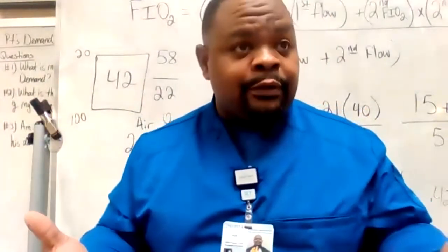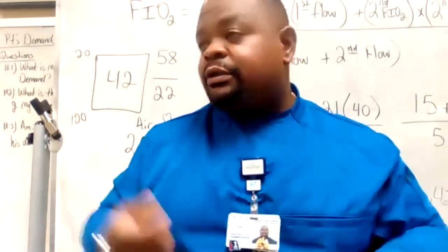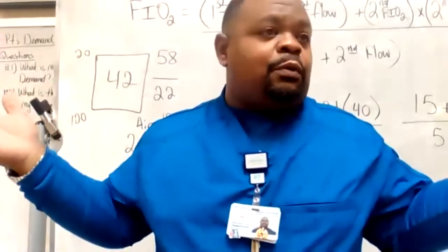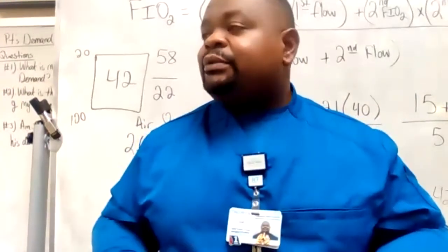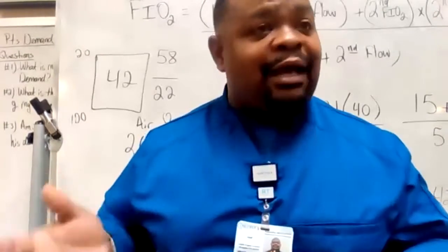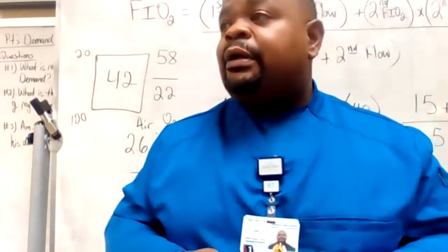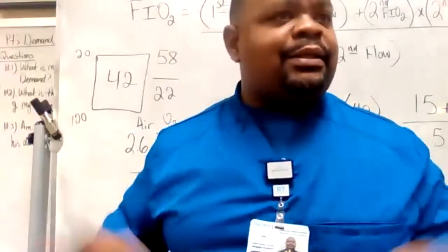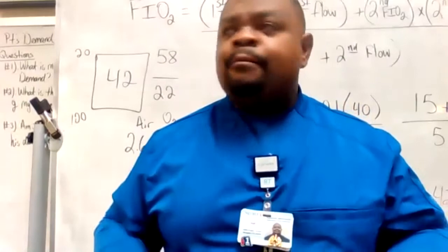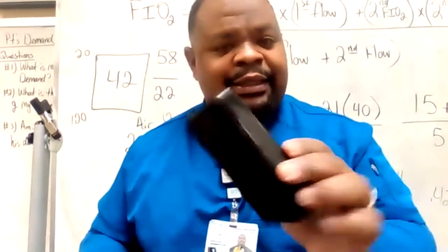Now, in a good hospital that's not in the country somewhere, you wouldn't have to do that. You would have a blender, right? And I showed you the blender. One hooks up to the wall on the air, one hooks up to the oxygen. You just turn the FiO2 where you want it to be. You won't have to do all of that. But some rural hospitals don't have all of that, guys. So you have to be able to do that. If you get hired somewhere and they say, well, we don't have that, then you say, well, okay, let's hook it up like this. Done.